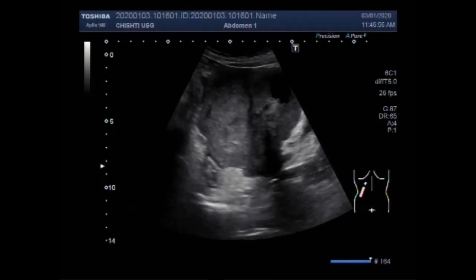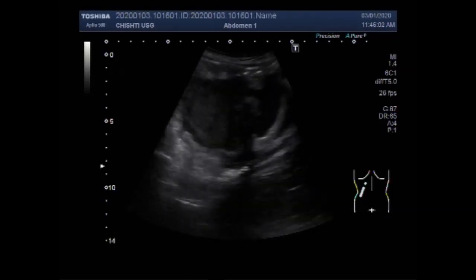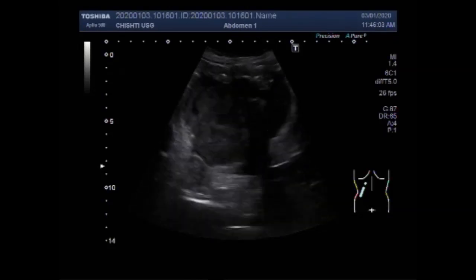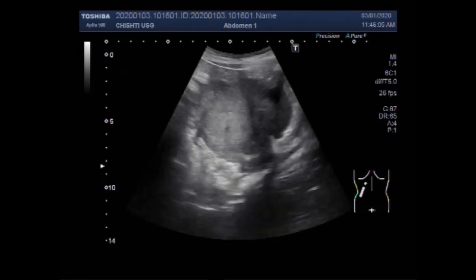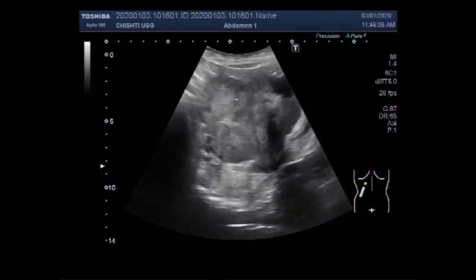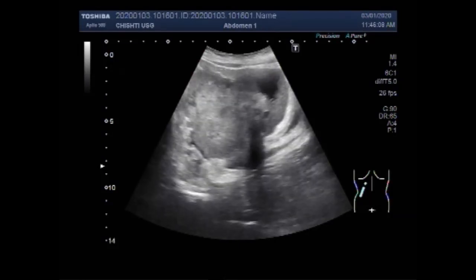Dear viewers, I hope you are all fine. This ultrasound video shows an ovarian mass in a patient of about 55 years of age.